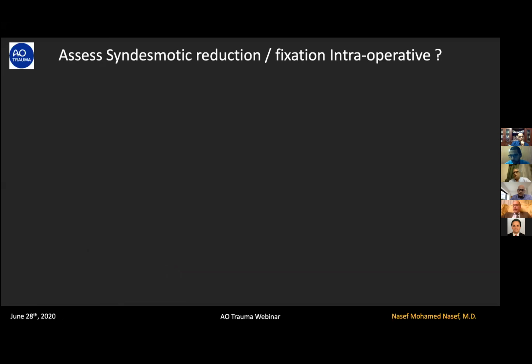Yes, in some cases, the syndesmosis is completely dislocated. And you have to reduce it. Then you have to see the incisura. You have to see the incisura because I saw many cases where the fibula was fixed either in front of the incisura or behind the incisura by 2 screws, because the surgeon fixed them blindly. So you have to see the incisura.